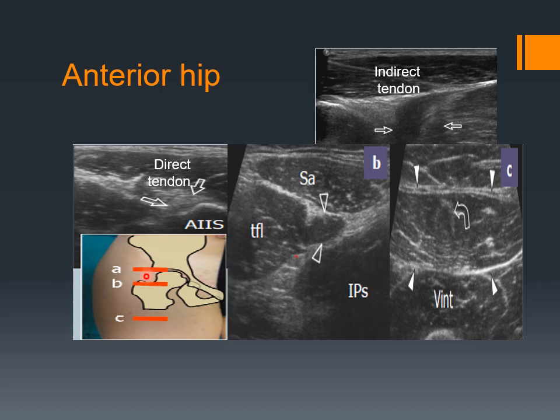femoris muscle. Usually we start the examination by starting from the muscle bulk down in the thigh, where we see the ovoid rectus femoris muscle, which is the superficial muscle. Below it are the vasti muscles. In the middle, we can see here the central aponeurosis of the muscle. Then we follow up the muscle upwards. We notice here that there is a decrease in the size of the muscle, and this is the myotendinous junction starting to appear.